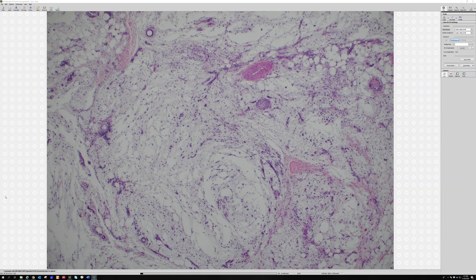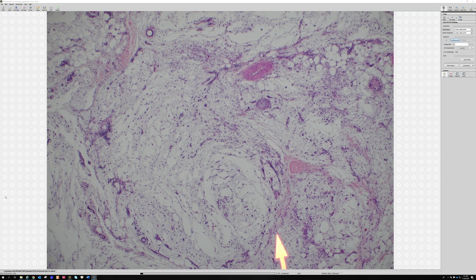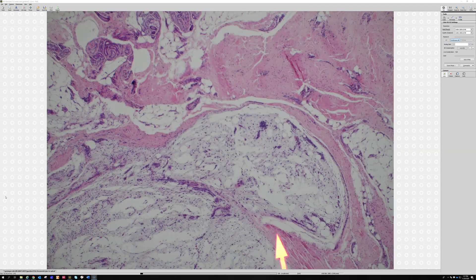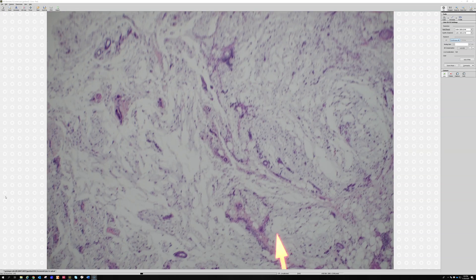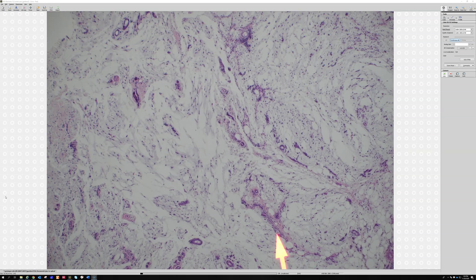So: myxoid background, prominent curving elongated vessels, scattered pleomorphic cells. As it begins to get higher grade into grade two, the cells will start to clump and cluster together along the vessels. Grade three will have sheets of stuff that looks like high-grade sarcoma, like UPS — solid areas that look like that, and then other areas that are loose and myxoid.